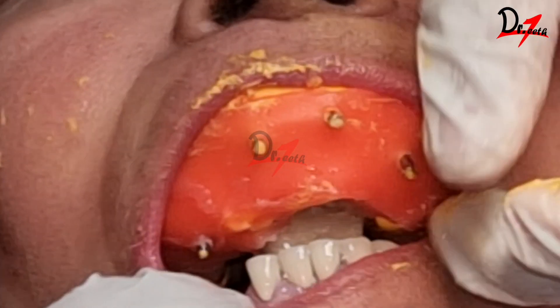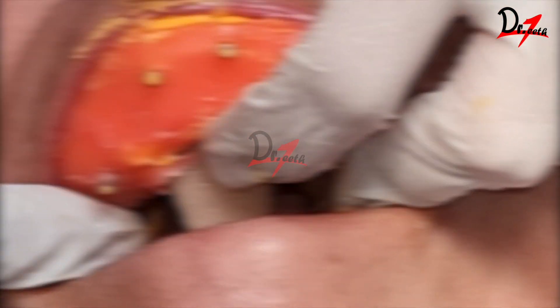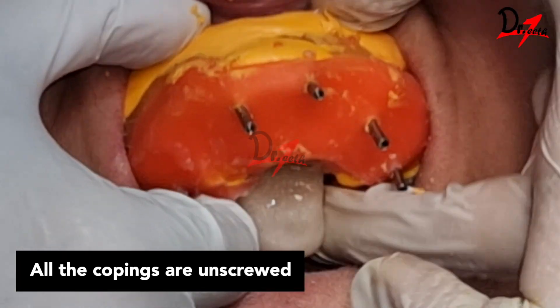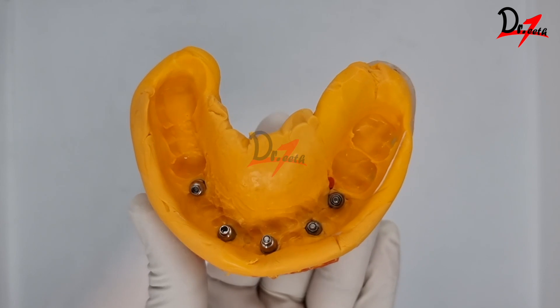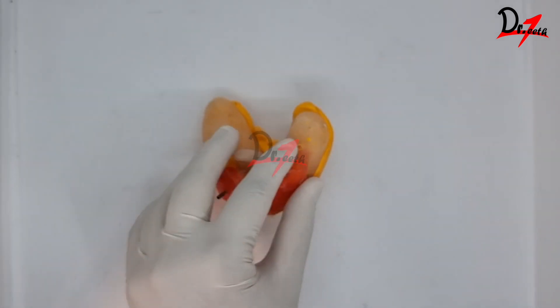You can see that the guide pins are poking out. Once the material is set, we will unscrew the impression coping and remove the impression. Here we have our impression, and the impression copings are embedded into it.